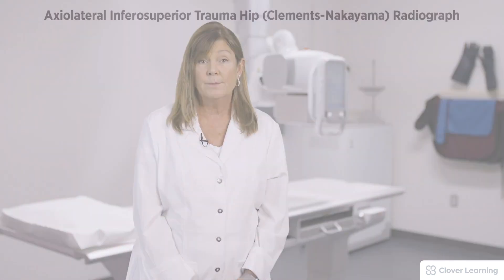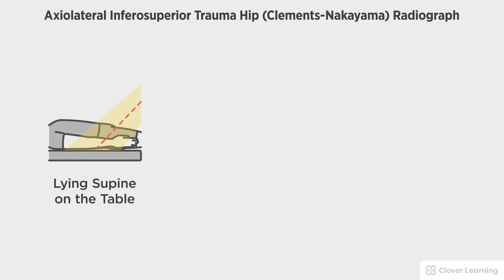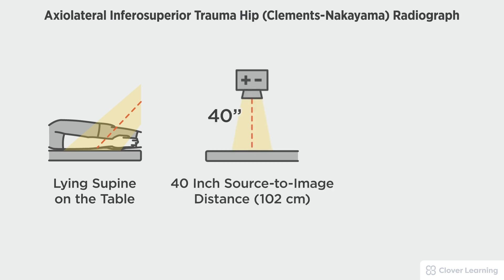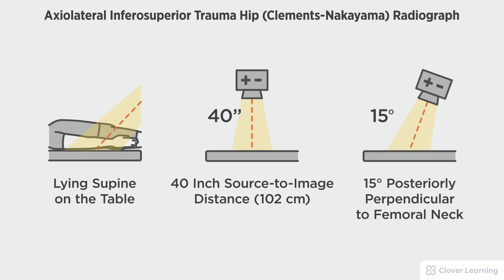In this view we will be demonstrating an axial lateral inferior-superior trauma hip, the Clemens-Nakayama view. This view should be performed with a patient lying supine on the table, a 40-inch source-to-image distance, and tube angle directed 15 degrees posteriorly and aligned perpendicular to the femoral neck.